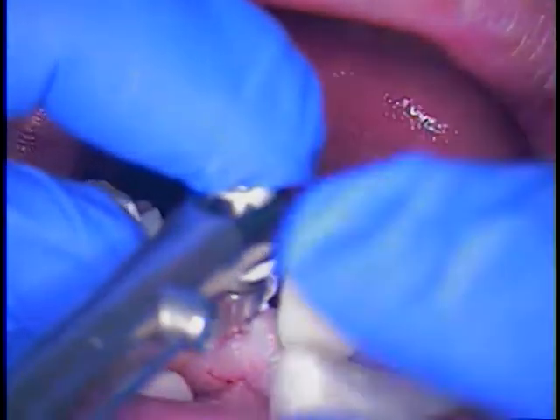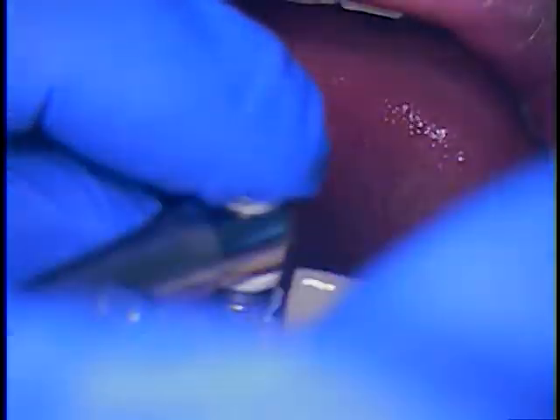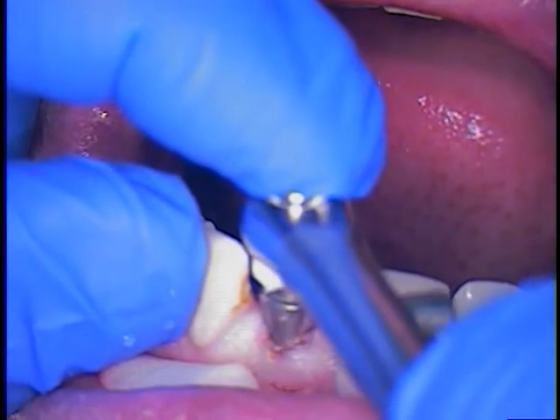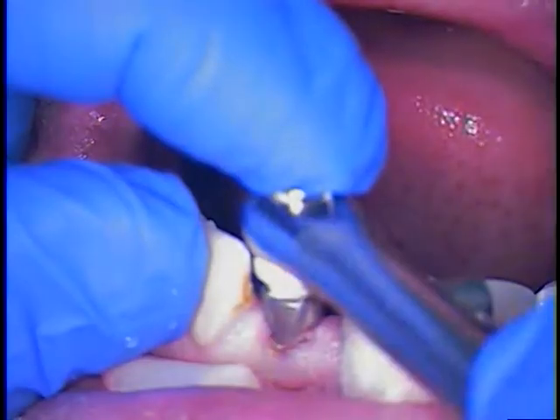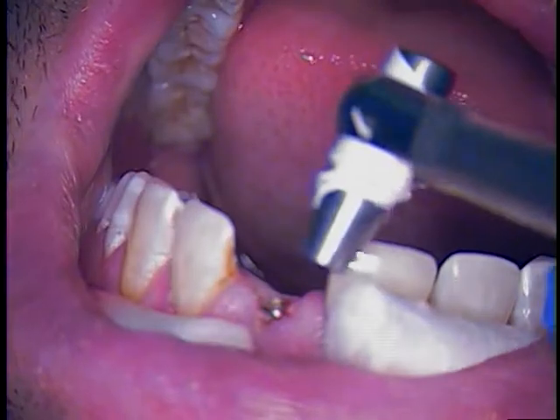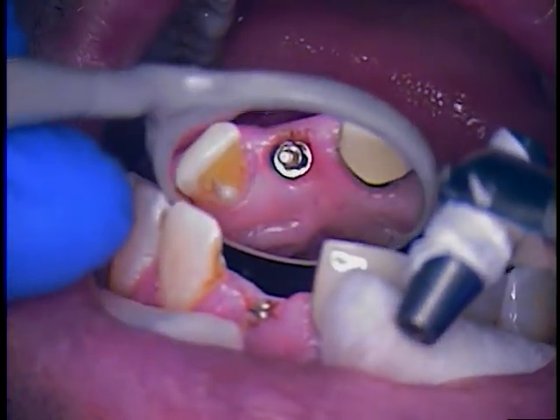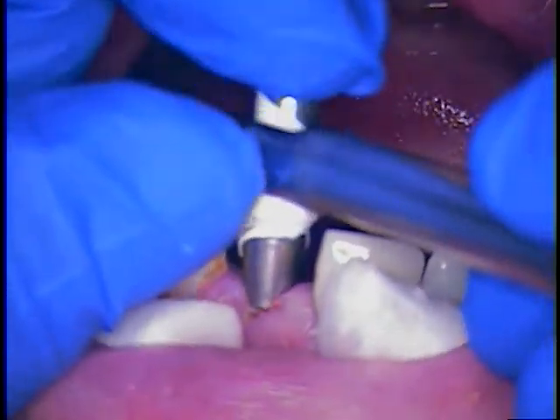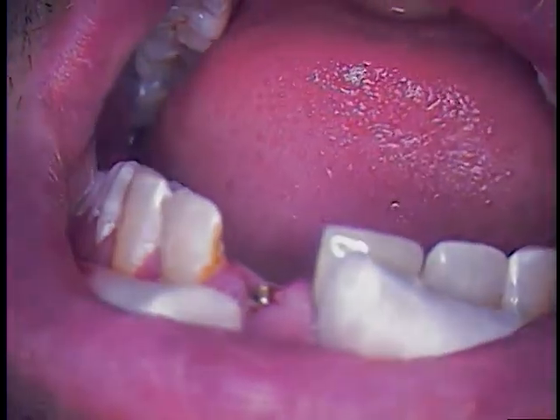So I've secured the driver, making sure it seats all the way. That's the key. Looks like we've got something coming now. All right. So it's a hex driver. And, definitely moving this baby out. All right. Success on getting this to come out.